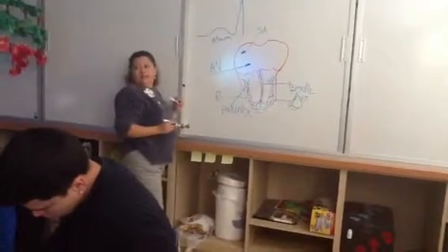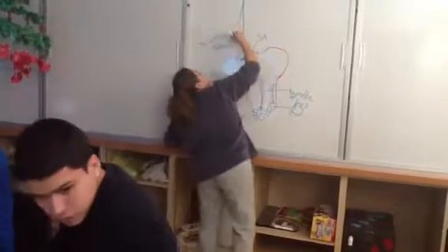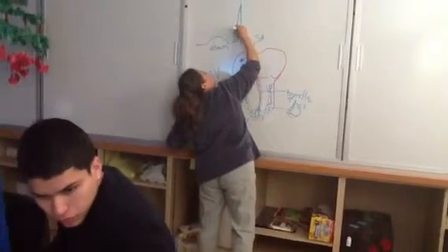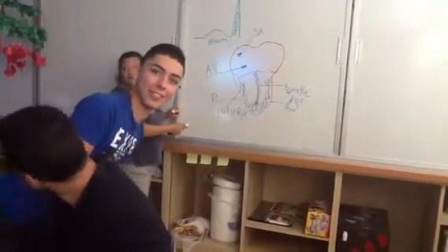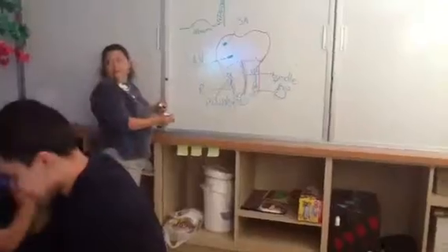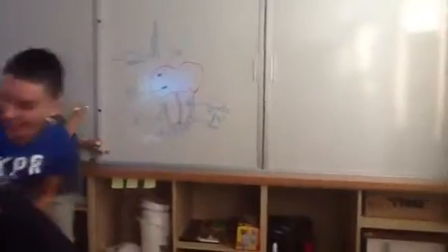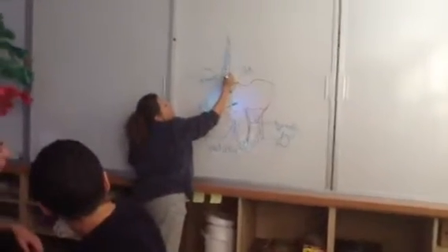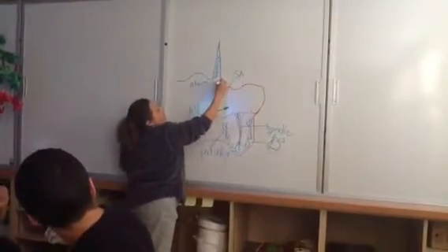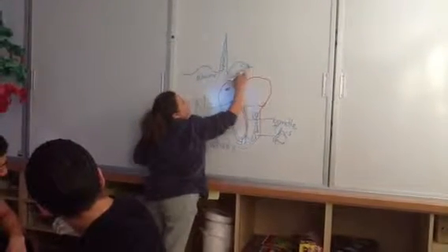Okay. So that's the whole ventricle. So this is the ventricle in here. The peak is your ventricle, and that's the bottom half of the heart. So the top half, the atrium, is the hump, and the bottom half, the ventricle, is the spike, the peak. Then it's going to go back to the isoelectric line, a little bit lower down here, your T wave, and then it starts back up and makes another hump, which is like the U wave.